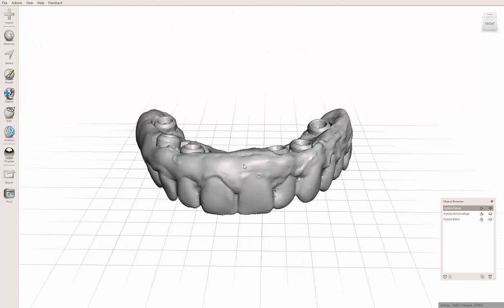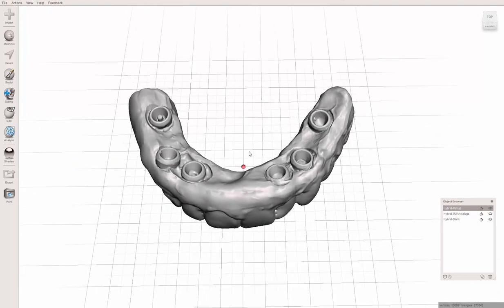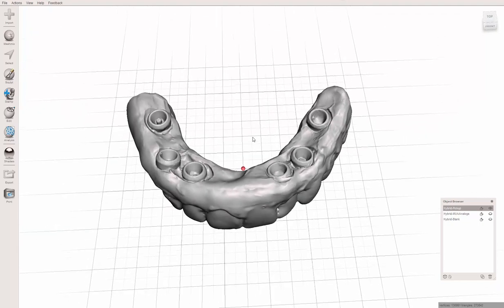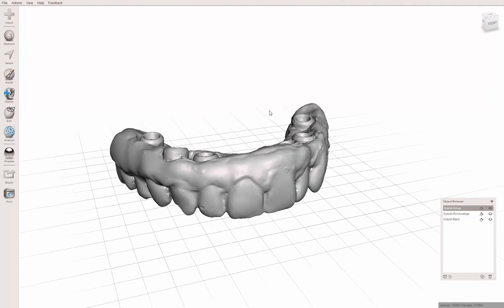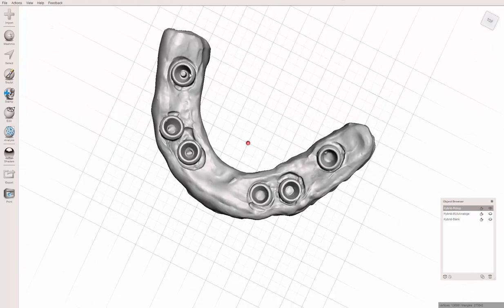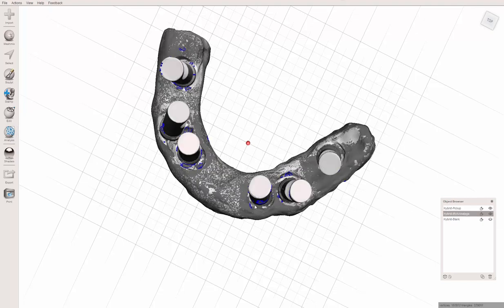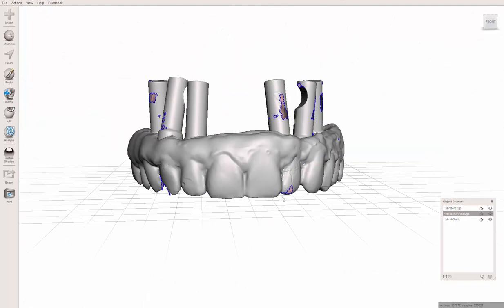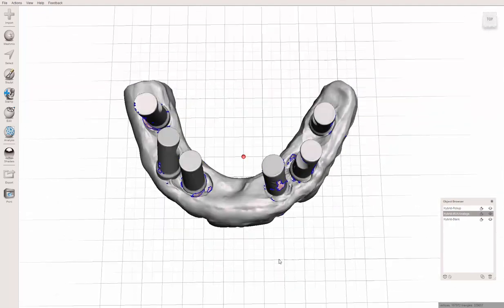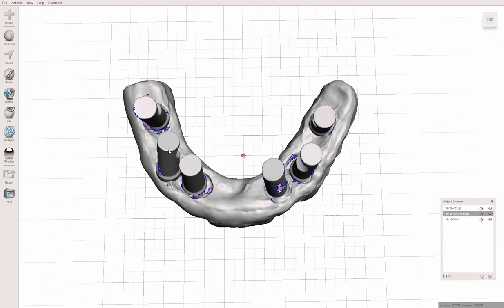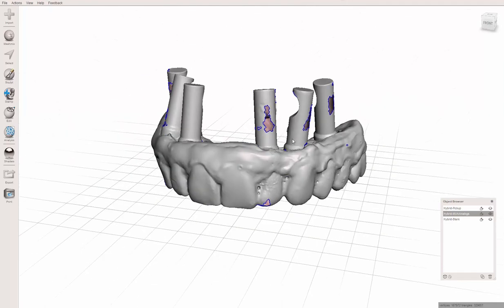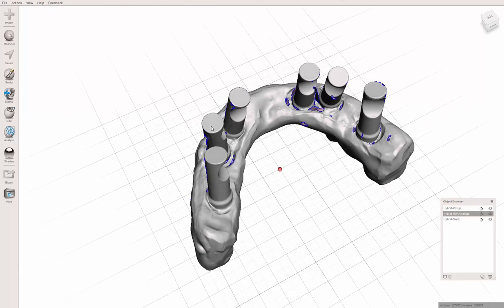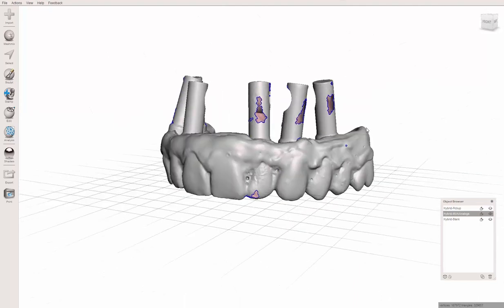I've scanned the entire thing with my intraoral scanner to make this 3D object. I'm using the CareStream CS3600 for this scan, but a lot of cameras have the same purposes. I'm pretty confident in scanning a physical object outside the mouth that can be dried off in a controlled environment. It's one solid shell, so you can trust it.